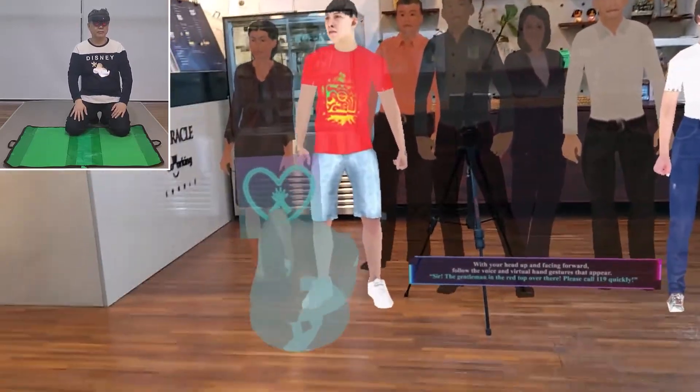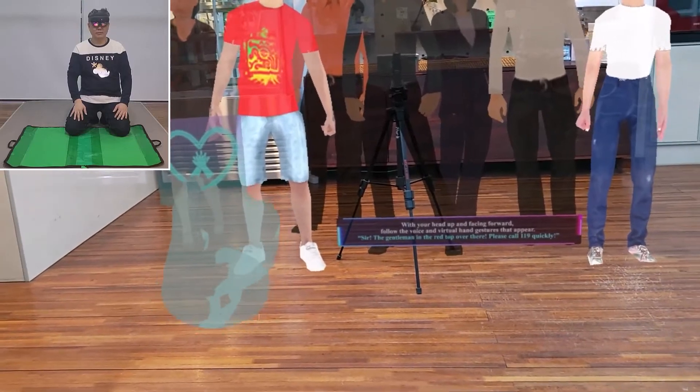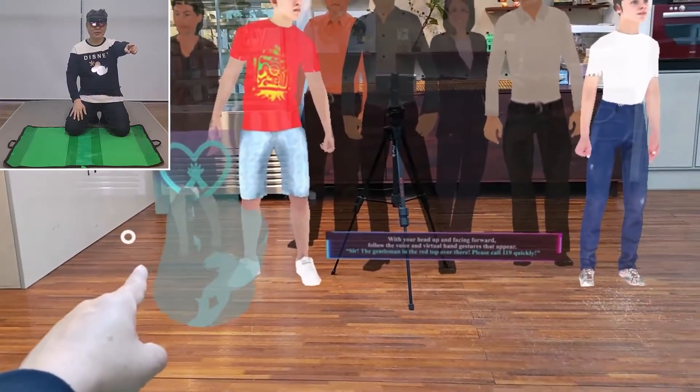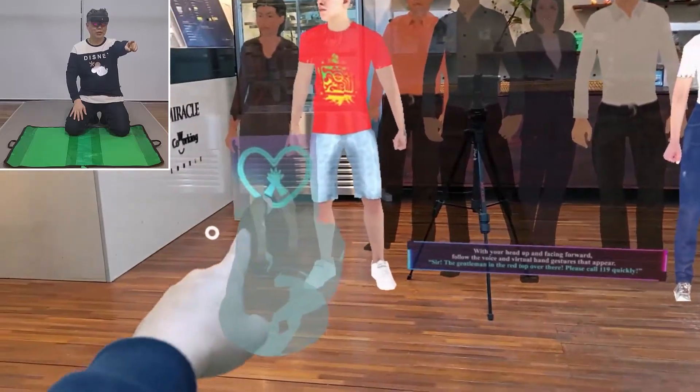Sir, the gentleman in the red top over there — please call 119 quickly.